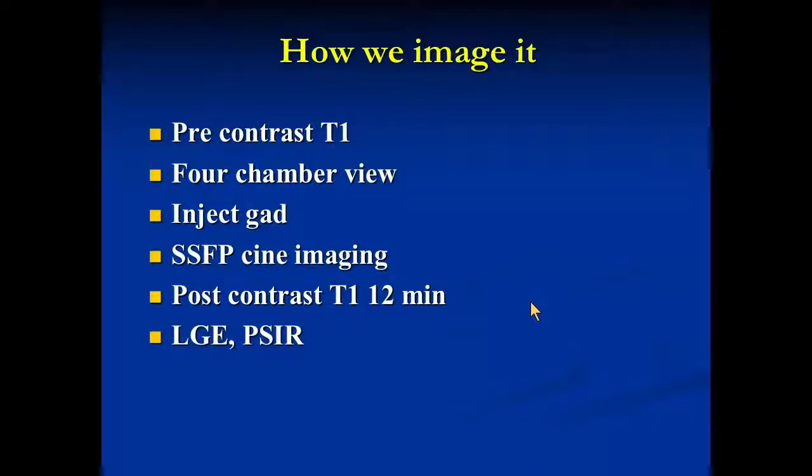more T1 data, and at that point we look at the LGE and the PSIR images, and you're going to hear the details and the physics of that by Dr. Kelman, who actually developed PSIR. And then we generally obtain post-contrast at about 20-25 minutes.